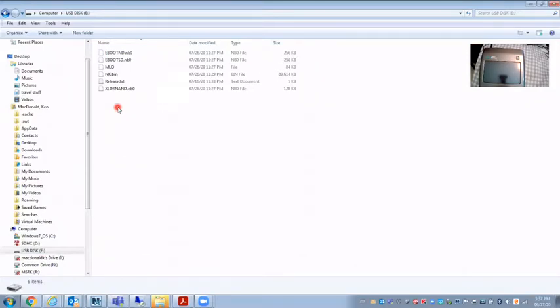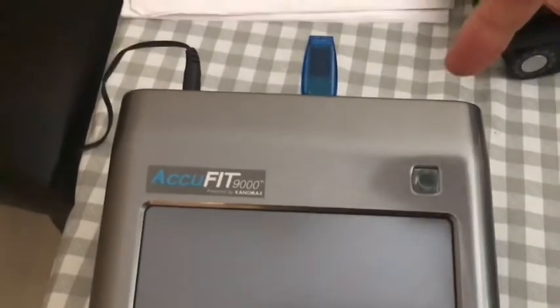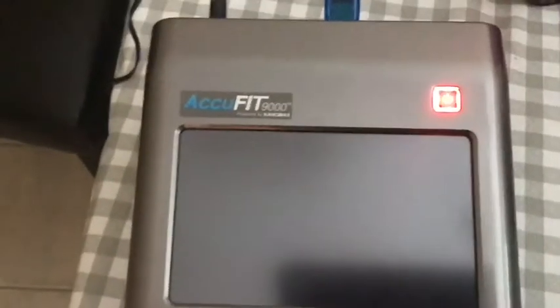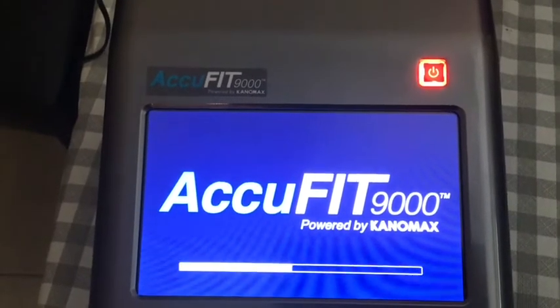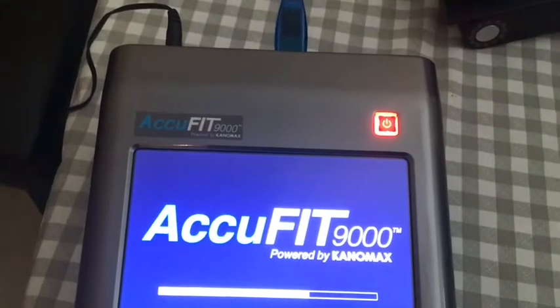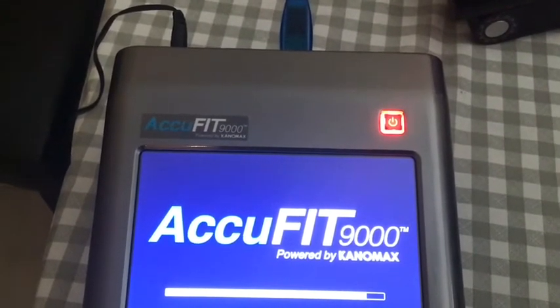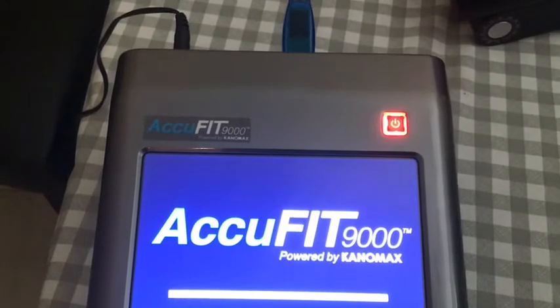I'm going to insert the USB flash drive into one of the USB ports on the back of the AccuFit and turn it on. It's reading off the USB stick and I'm going to turn it on.